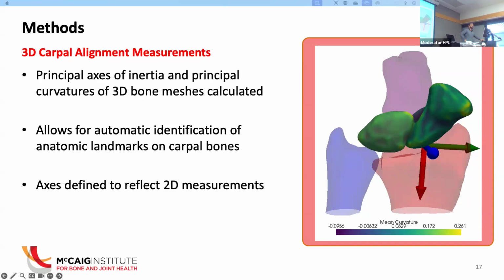Okay, last question. What about differences in these measurements between contralateral limbs of the healthy person? So just regular asymmetry in healthy. Yeah, so that's going to be another one of my next steps. We don't have a contralateral in the unloaded scan, but we do have it in the load bearing position. So I'll definitely be looking at that just to see if there's differences between how you load. I think that's a very interesting direction moving forward for sure.